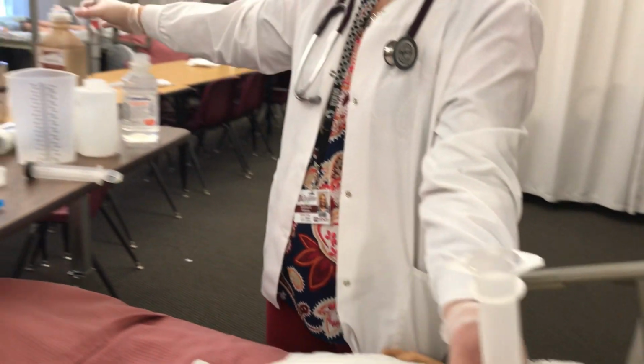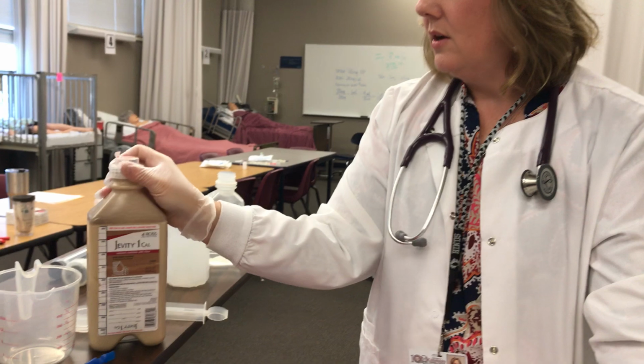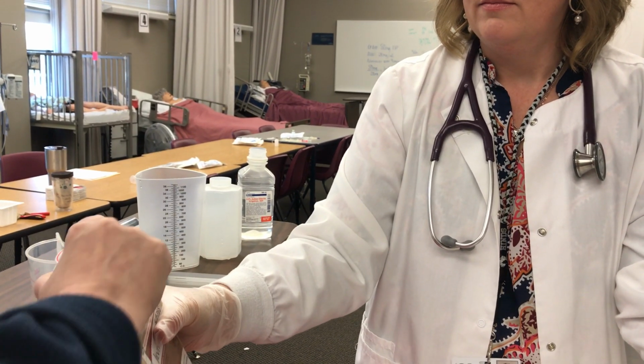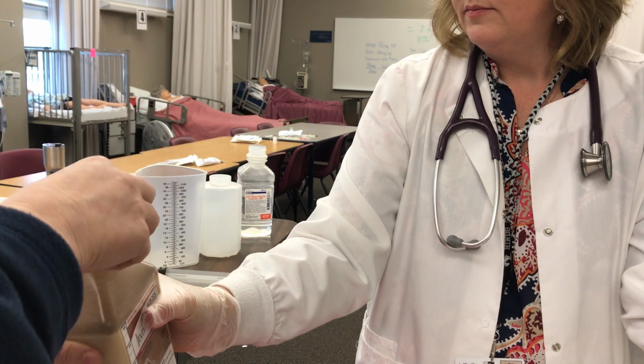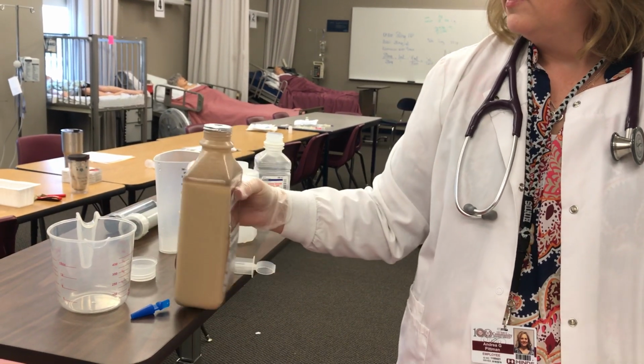The Jevity that I'm going to use, the doctor says to use 100 cc's. So we'll pour that up. Has a cap on it. Let's see.